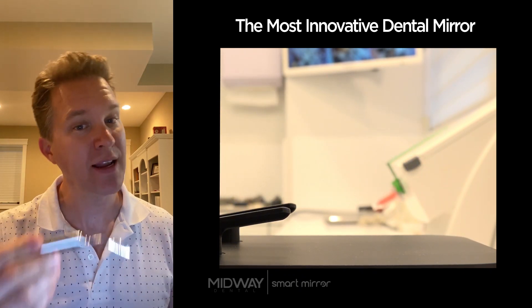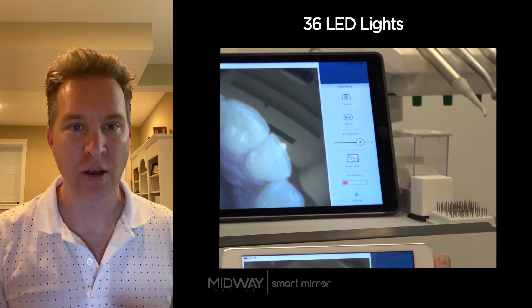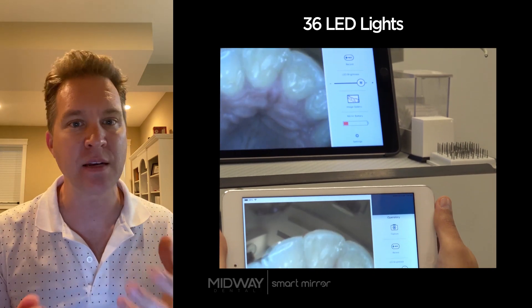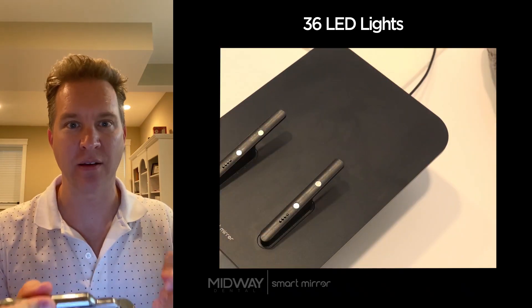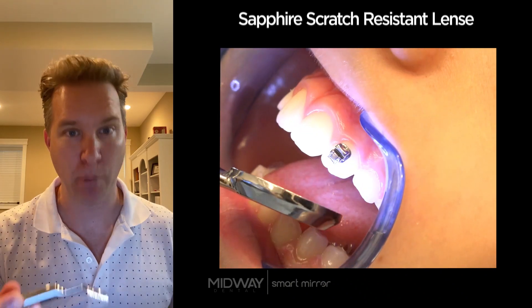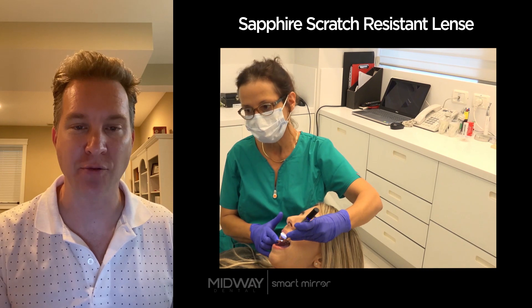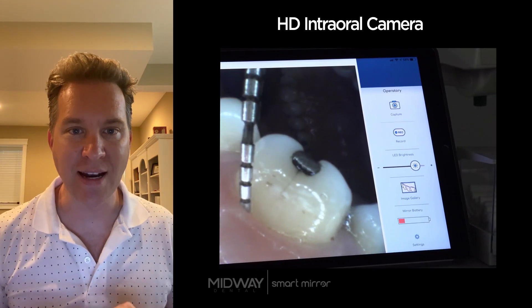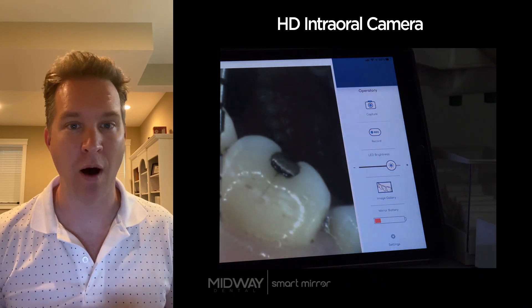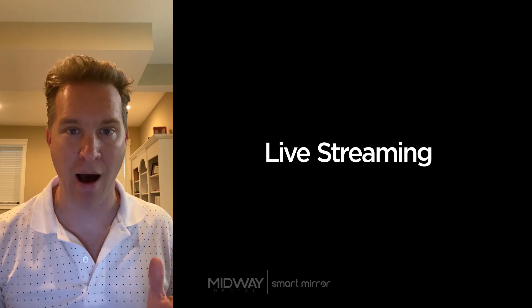The SmartMirror is a dental mirror with 36 LEDs that surround the mirror, flooding the oral cavity with light. The LEDs emit heat which warms the lens, preventing it from fogging — which is a nice perk. The lens itself is a sapphire lens, so it's highly scratch resistant, and in the center of the lens there's a pinhole HD intraoral camera. While the mirror is in your hand, it's always streaming live what's going on in the patient's mouth.